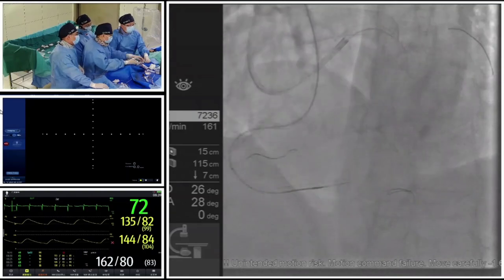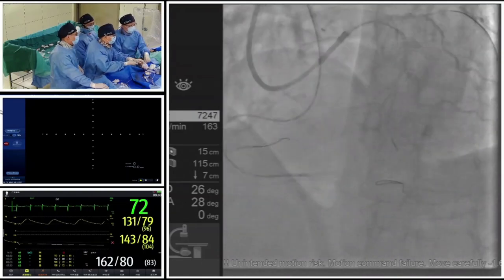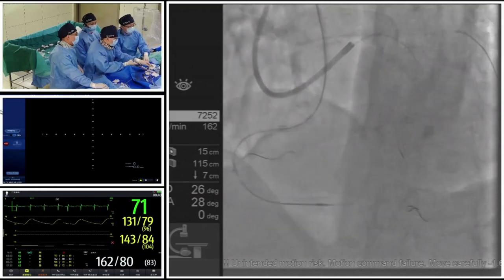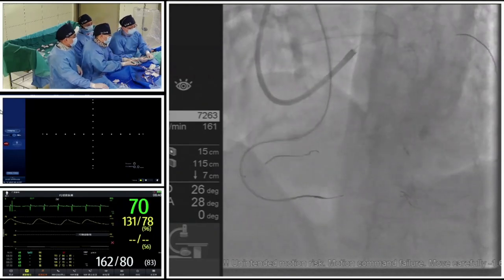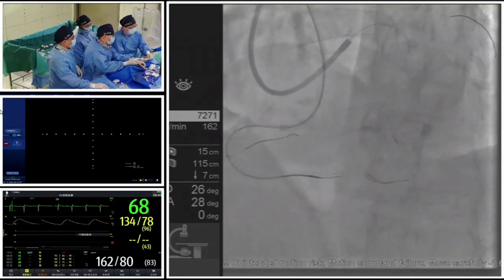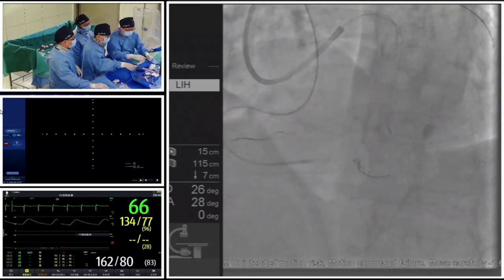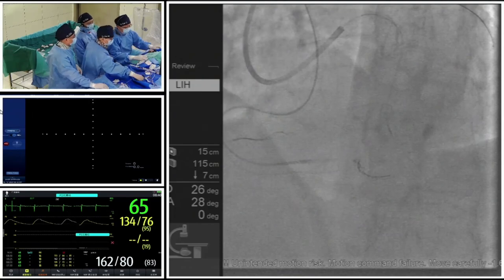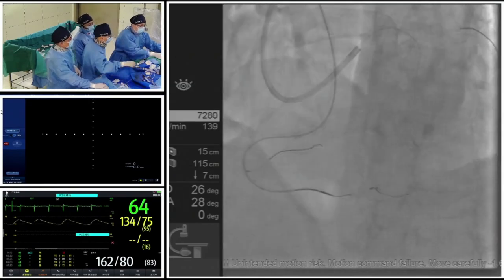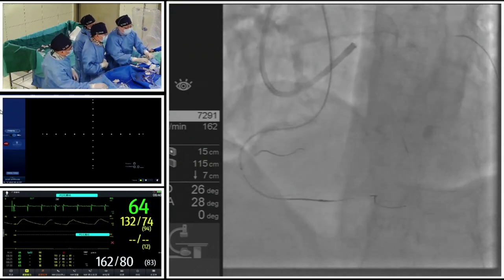Actually, for the antegrade wire, a small distal bend is preferred for the CTO antegrade approach to cross, because it enhances the penetrating capability of the guidewire and also reduces the likelihood of deflection outside the vessel architecture or into sub-branches arising within the occlusion. Here is the marker, okay?